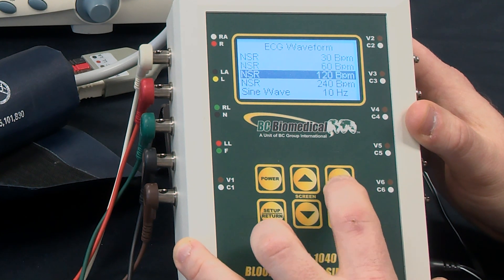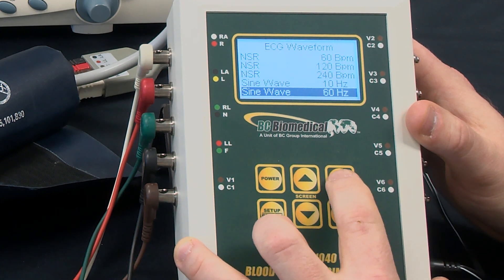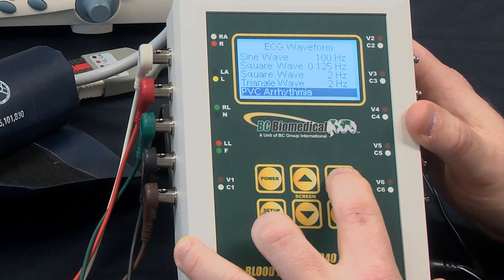We can scroll through heart rates: 30, 60, 120, 240 beats per minute. We can also go through our other performance waveforms like sine wave, square wave, triangle wave, and then our arrhythmias.